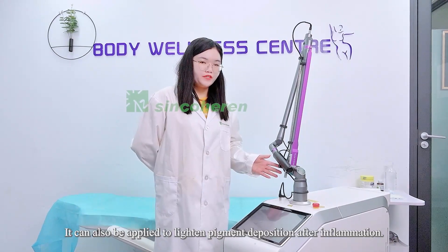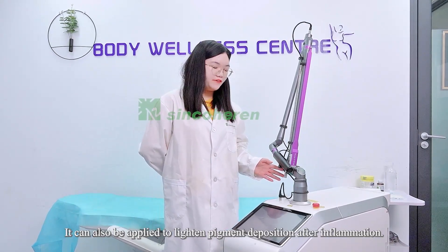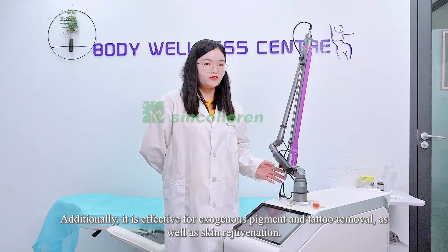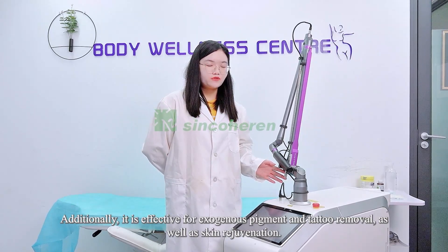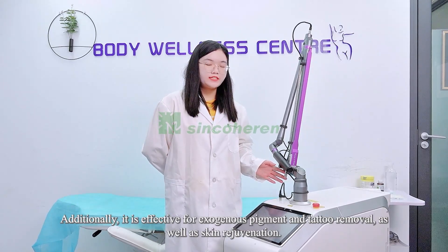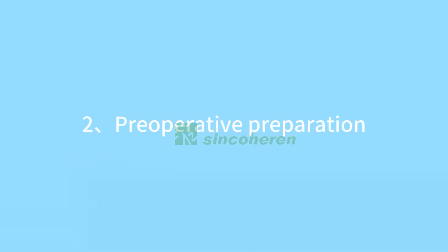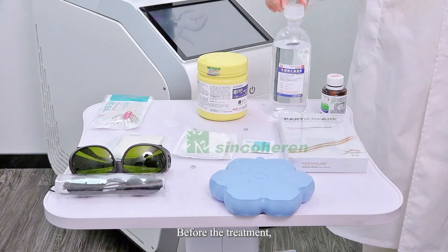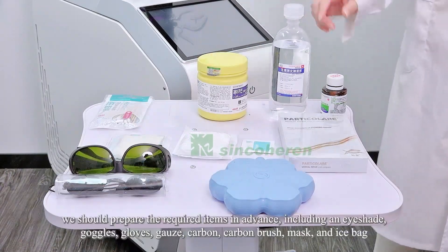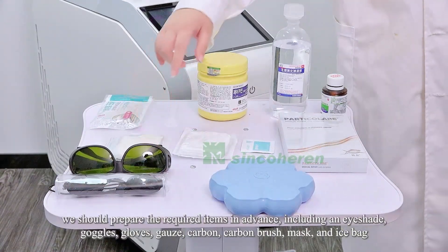It can also be applied to lighten pigment deposition after inflammation. Additionally, it is effective for exogenous pigment and tattoo removal, as well as skin rejuvenation.